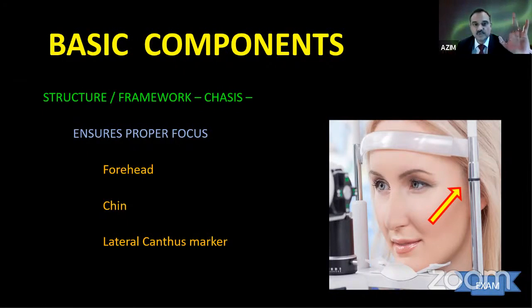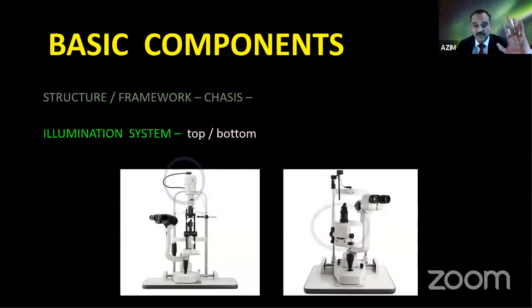This is a common mistake people make when they're learning the slit lamp. Make sure the patient is seated in this position before you start. Your life will be really easy.